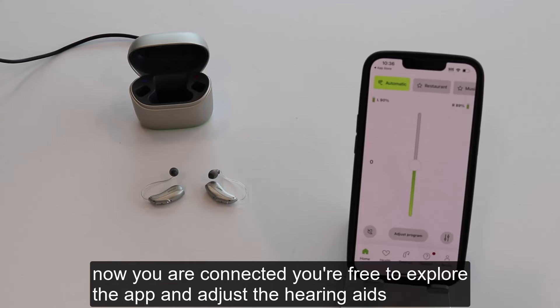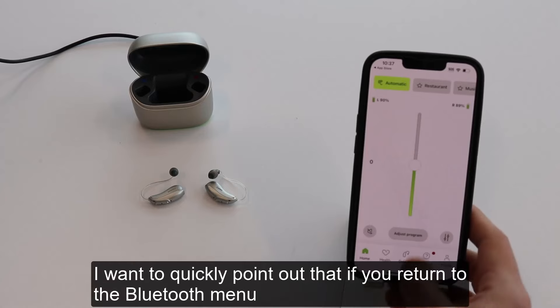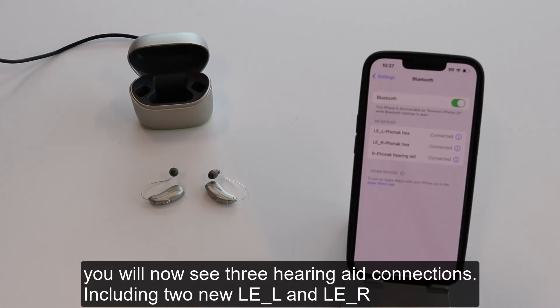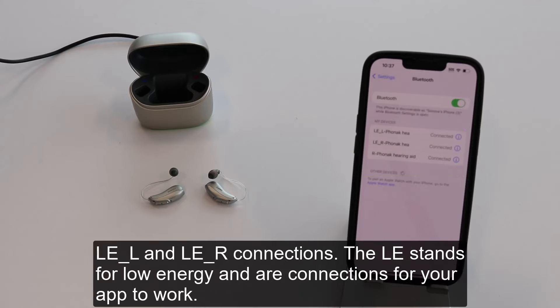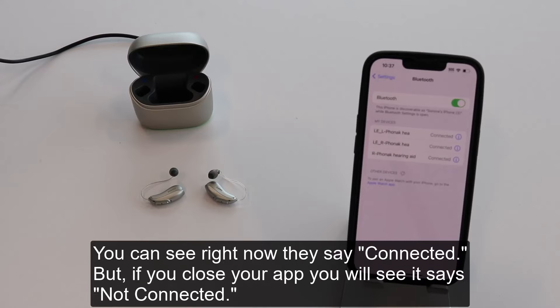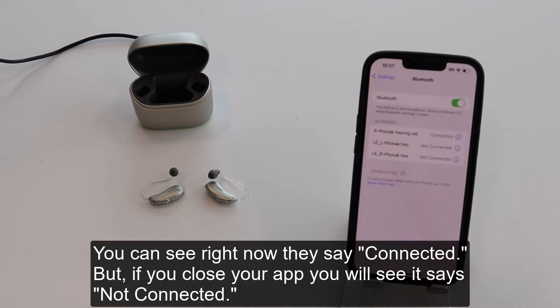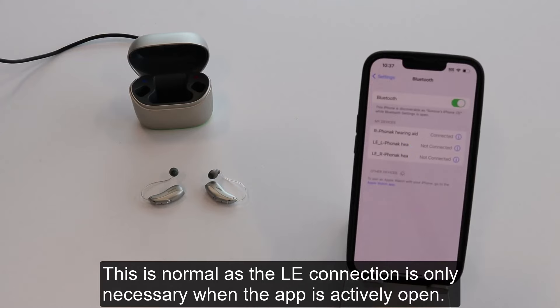Now that you are connected, you are free to explore the app and adjust the hearing aids. If you return to the Bluetooth menu, you will now see three hearing aid connections, including two new LE_L and LE_R connections. The LE stands for low energy and are connections for your app to work. Right now they say connected, but if you close your app, you will see it says not connected — this is normal, as the LE connection is only necessary when the app is actively open.